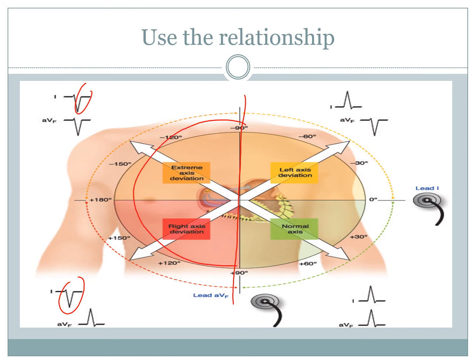As you can see, we don't get the breakdown of the 30 degrees, so we don't know the direction of the deviation, but we know that there's a potential problem that needs further investigation. And a lot of the time, that is enough, because from there you can go get a better ECG in a better facility and then have investigations done from there.